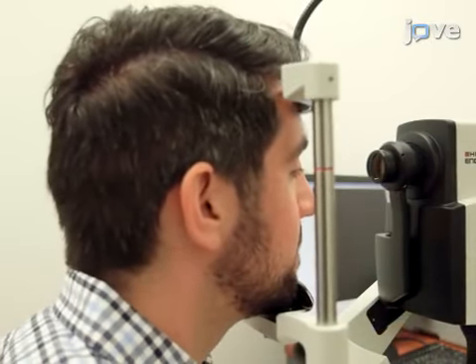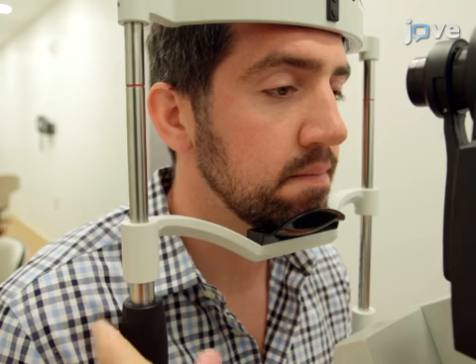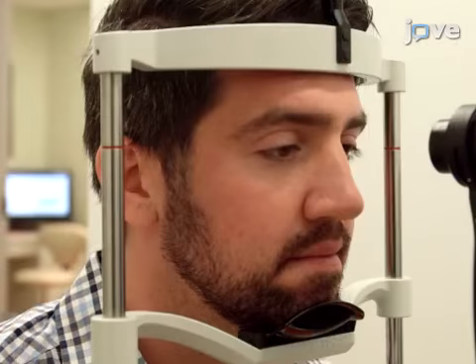Properly position the patient on the CSLO with chin resting on the chin rest, forehead placed against the forehead rest, and lateral canthi properly aligned with the indicators.